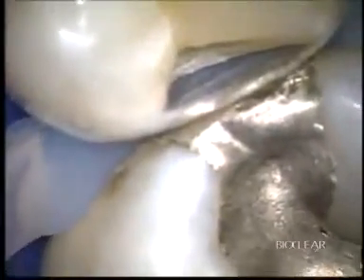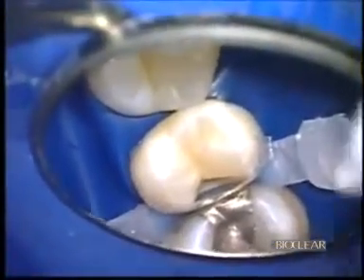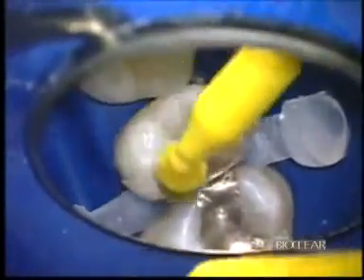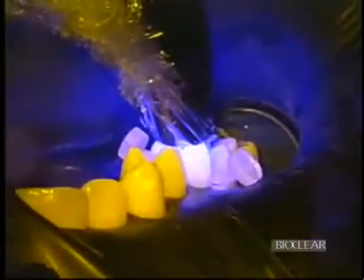Now I'm ready to etch. As an optional treatment, you can go ahead and put a little bit of liquid etch first because it's a little bit less viscous than the gel, and we're going to get an etch a little bit further past the finish lines. Once again, this is optional. Now I am placing the lightly filled bonding agent, which happens to be Optibond Solo Plus, with a micro applicator. I will go ahead and air thin the resin and then light cure.